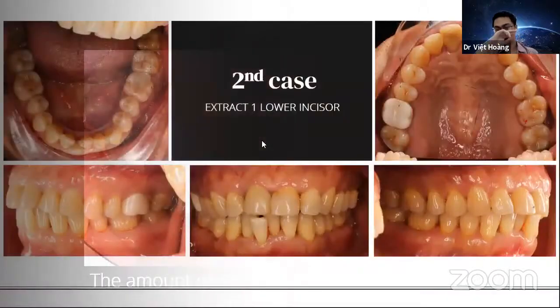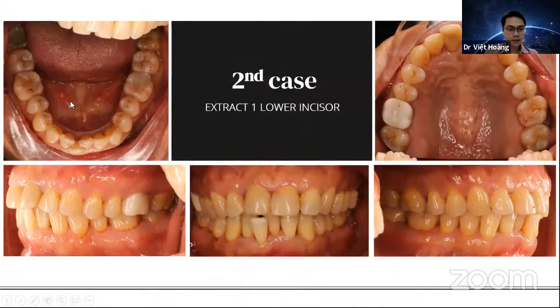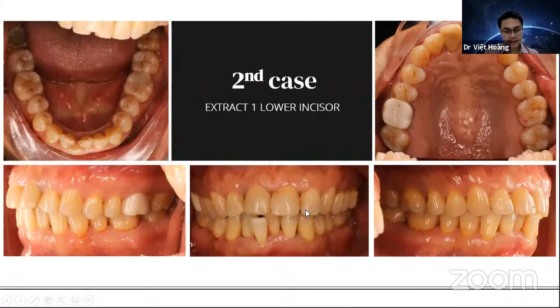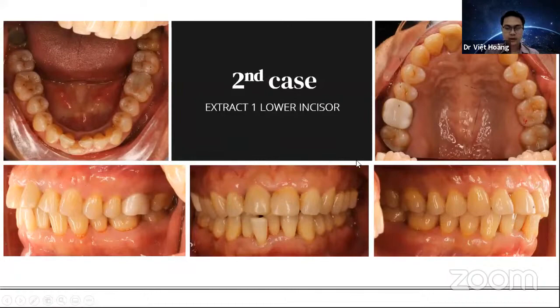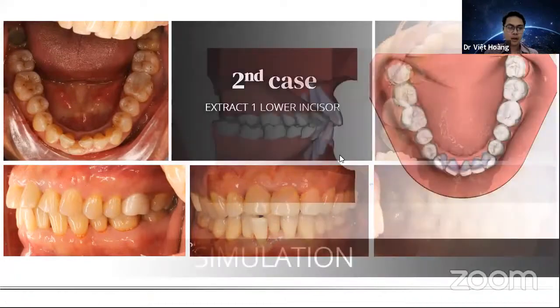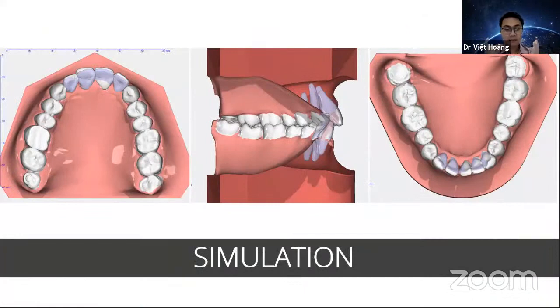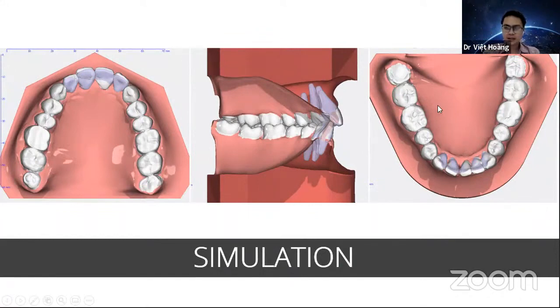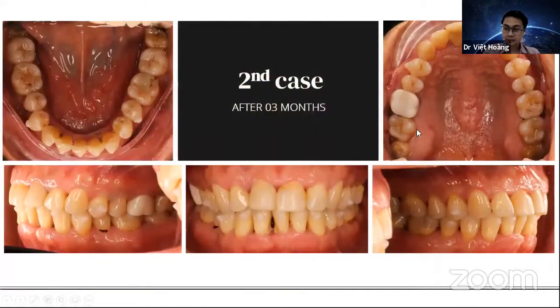Case: extracting one lower incisor, big crowding on the lower, good block occlusion, minimal crowding on upper. The patient wanted aligner treatment. The setup showed minimal movement needed on upper and lower — easy with aligner, treatment time less than six months. After three months, the progress picture shows the patient is happy.